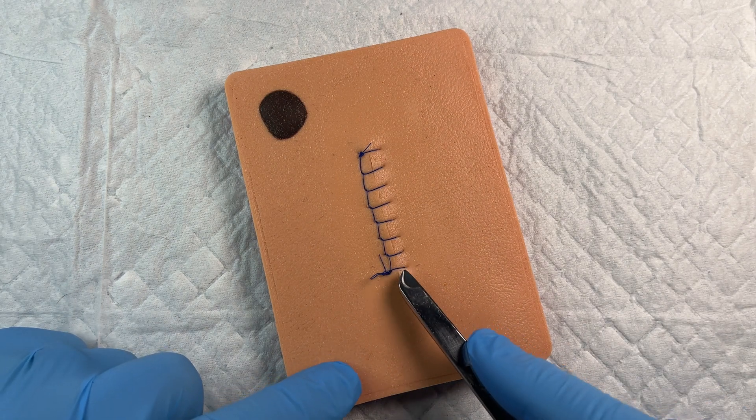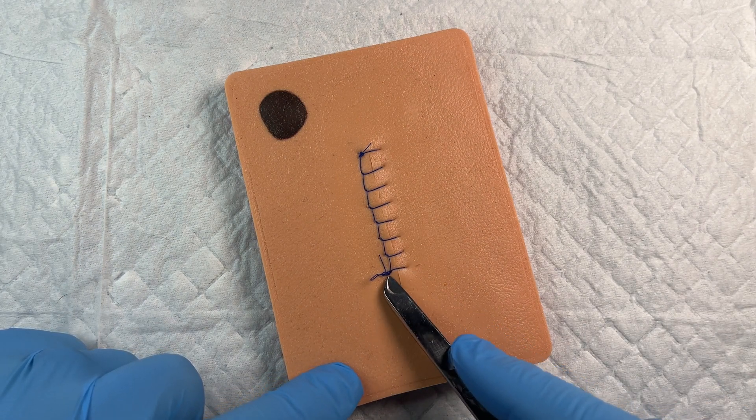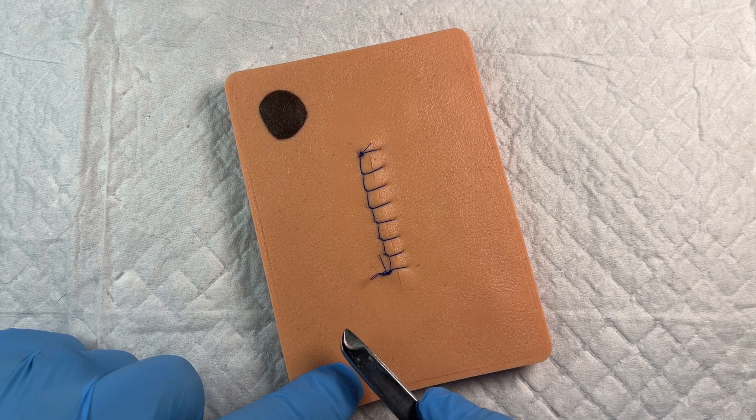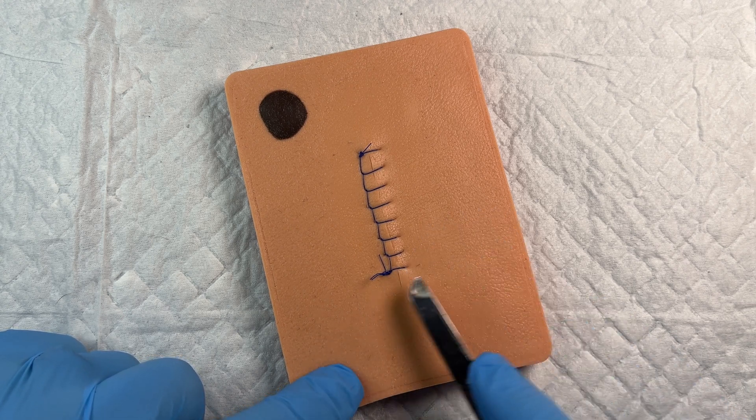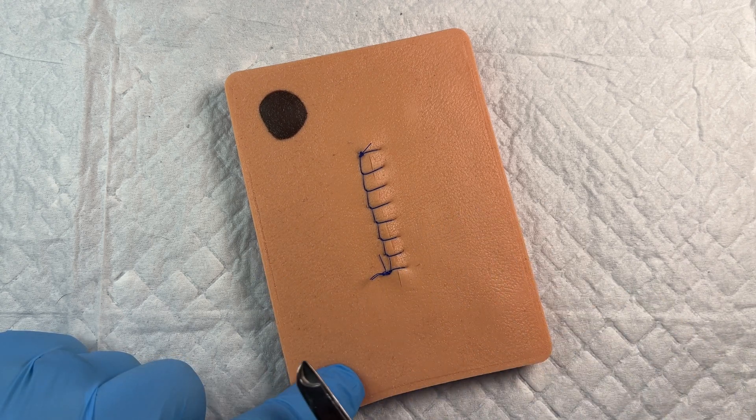but just remember when you are pulling these through, some of the suture could pull through the skin and you want to be careful down into the tissue and you don't want to drag bacteria down through the tissue.